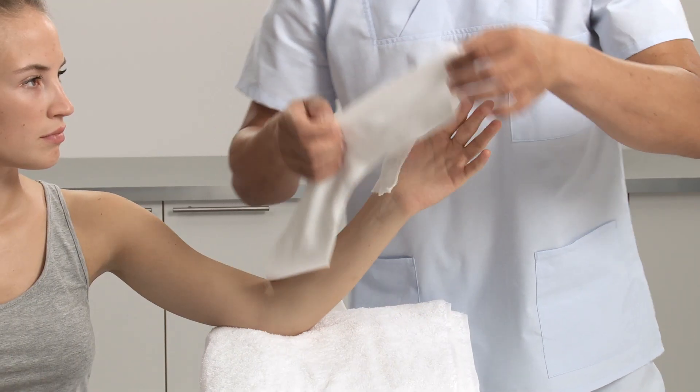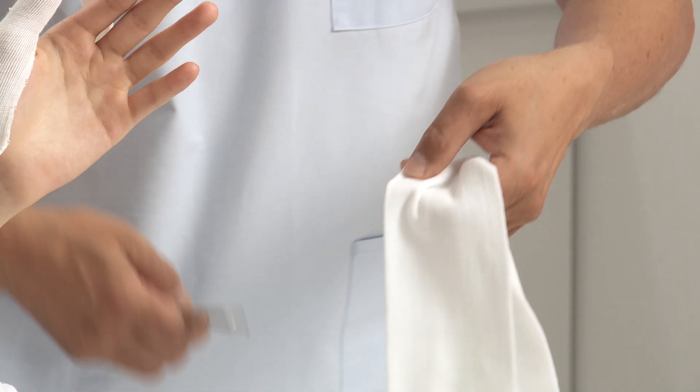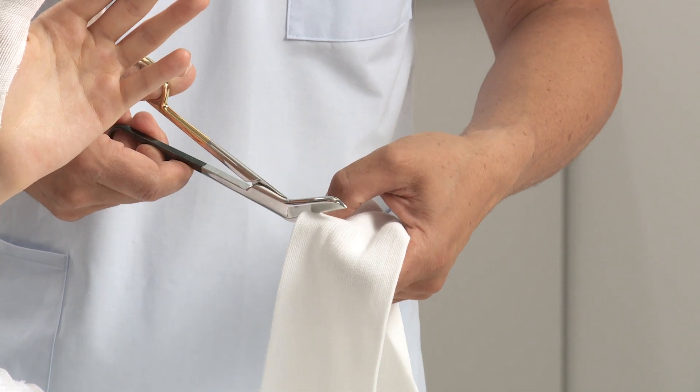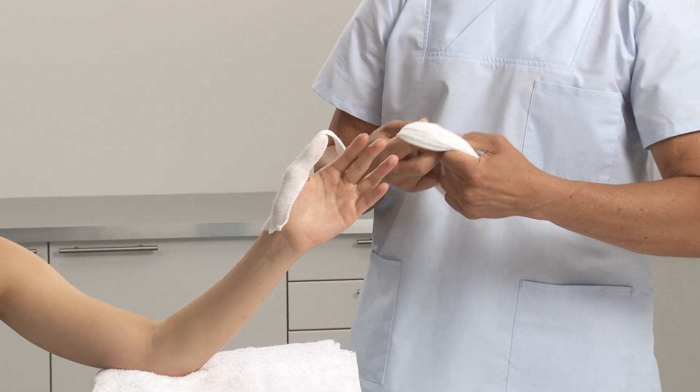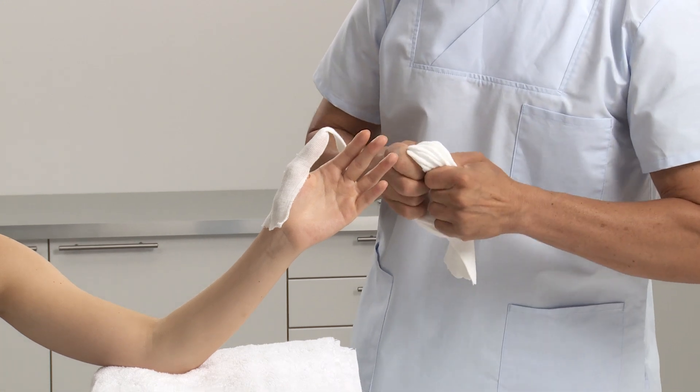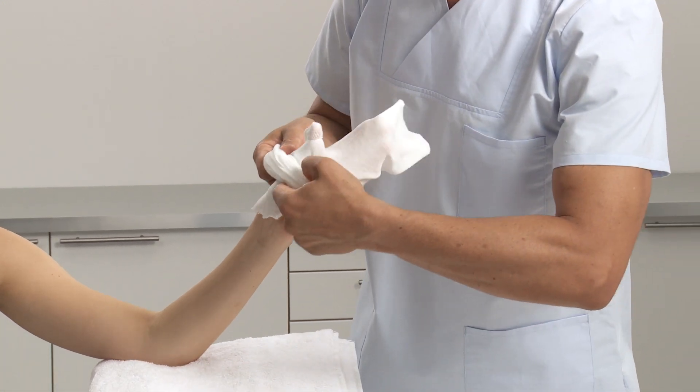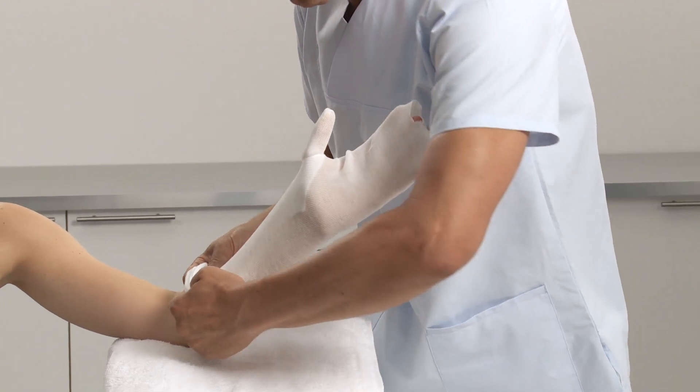Cut a hole into the arm stockinette at thumb height and roll it up before applying onto the limb to prevent sliding pressure during application. Roll off over the arm and smooth down, ensuring the thumb hole does not constrict the patient.